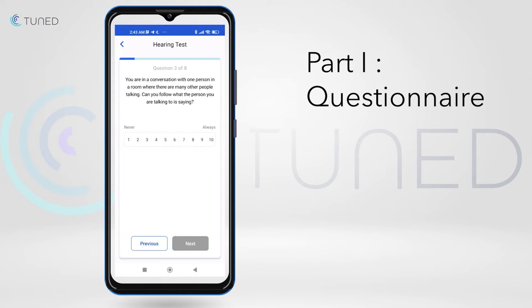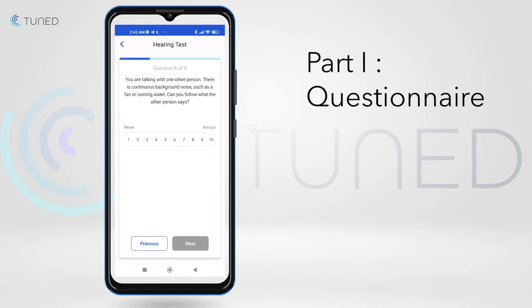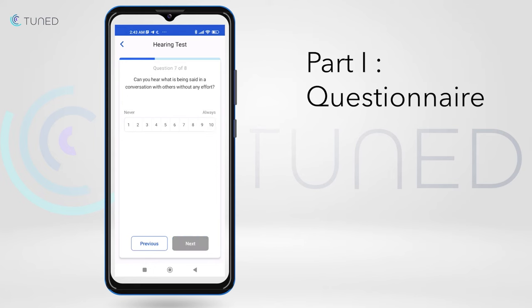The goal of the questionnaire is to assess the user's own perception of their hearing loss. To get the most accurate results, it is important to take the hearing test in a quiet environment.